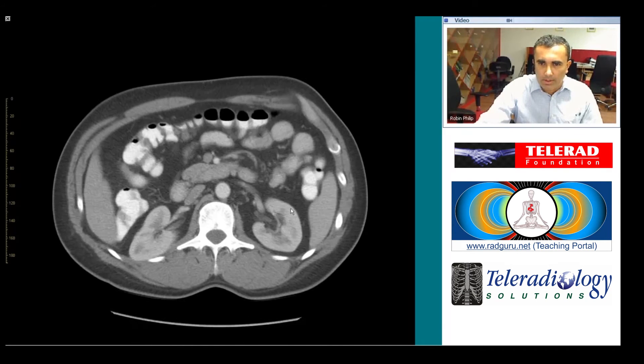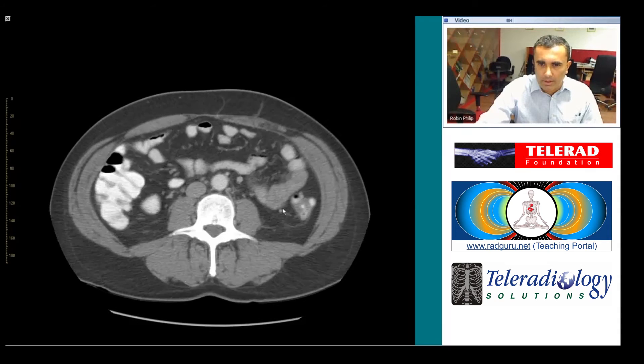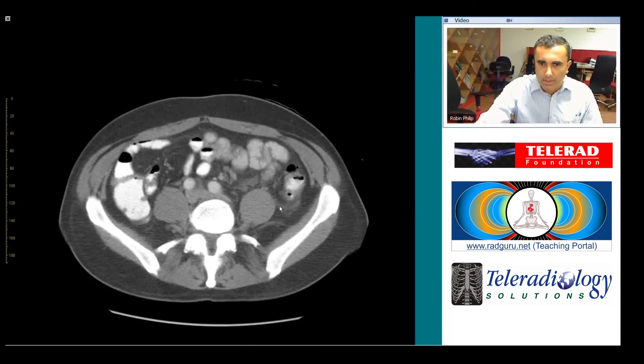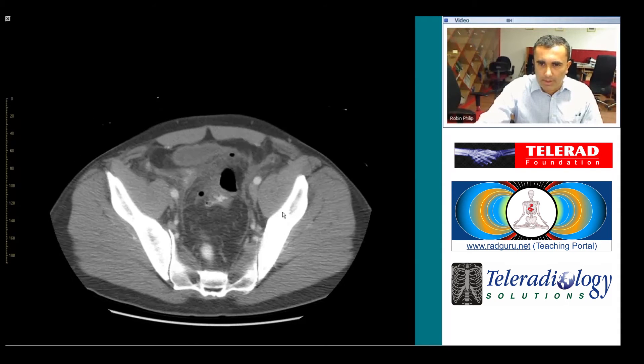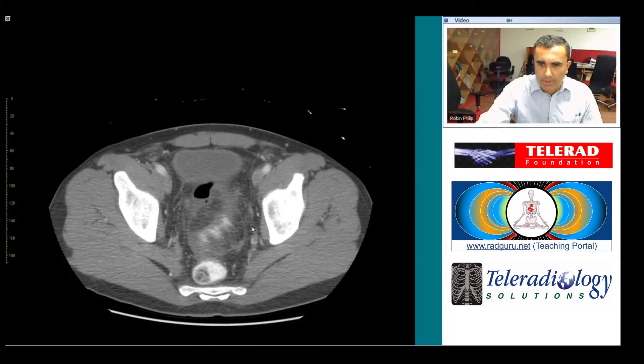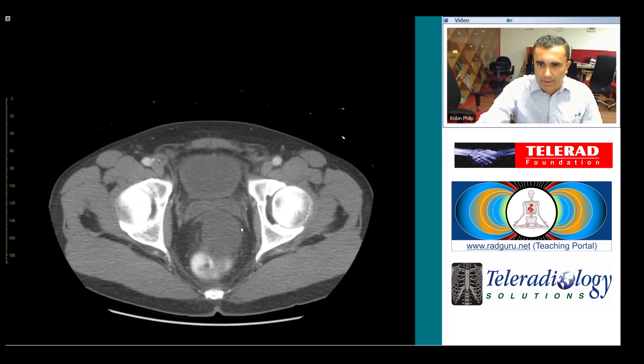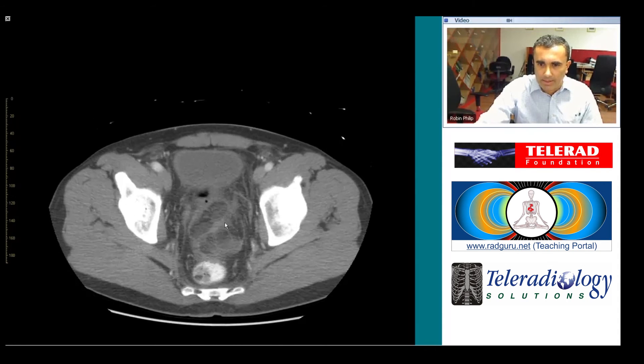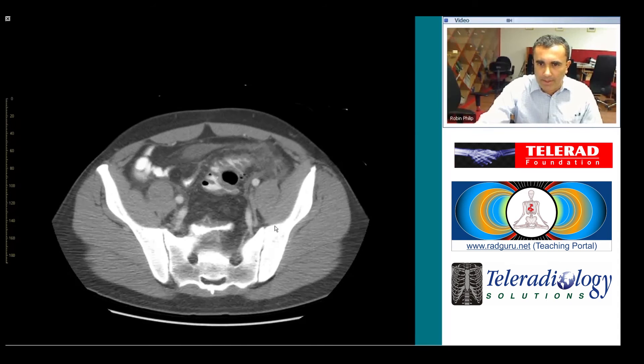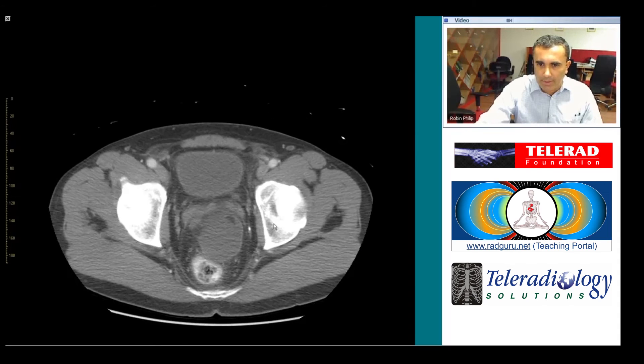This is a patient with perforated sigmoid diverticulitis, resulting in pelvic abscesses and free intraperitoneal air.